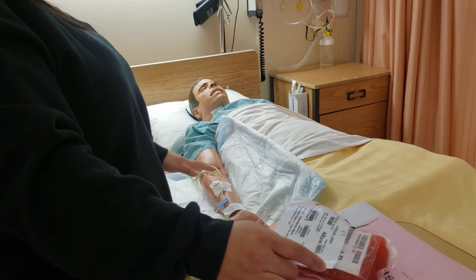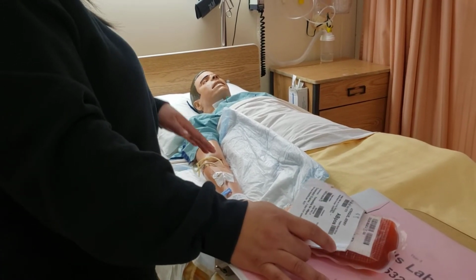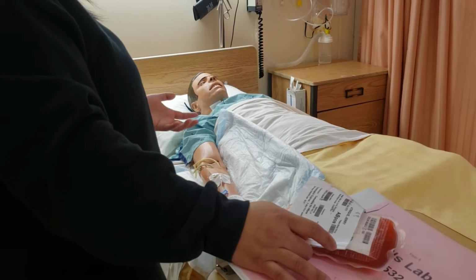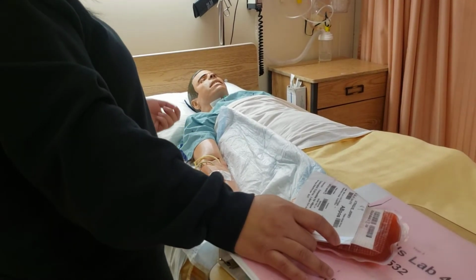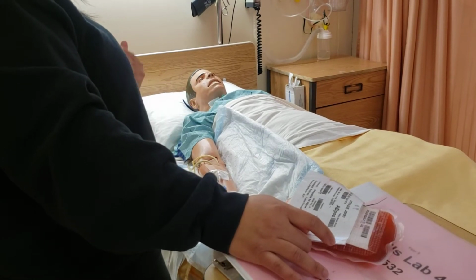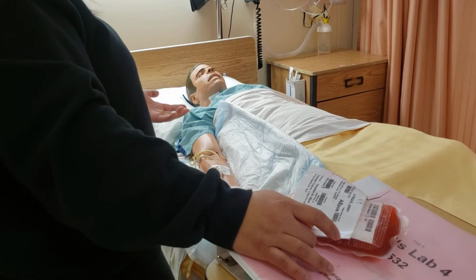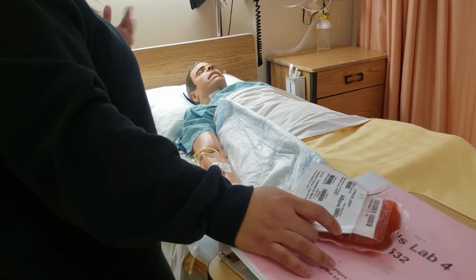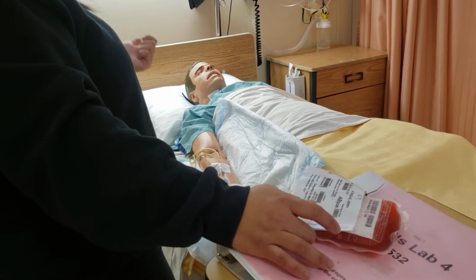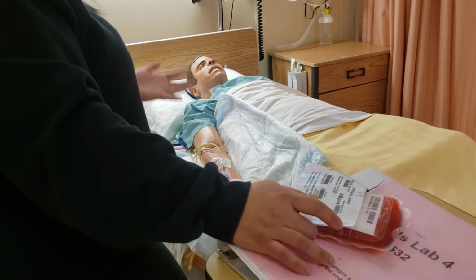I'll stay with you during the first 15 minutes of the transfusion, and I'll be assessing you for any transfusion reaction. Some of the signs of that can be if you're feeling numbness or tingling, if you're developing hives, if you're feeling itchy, if you are feeling very warm. If you feel any of those signs, it's important you let me know right away.